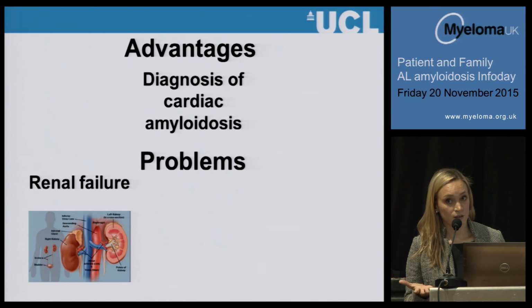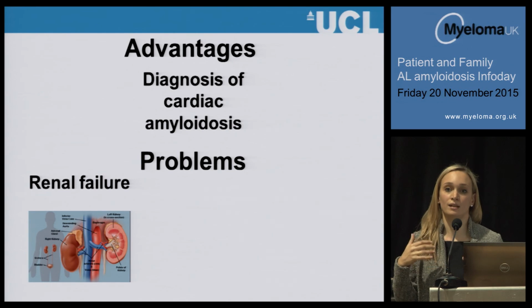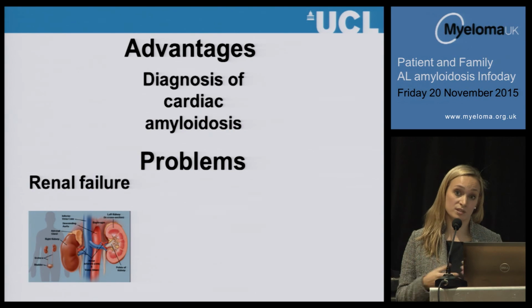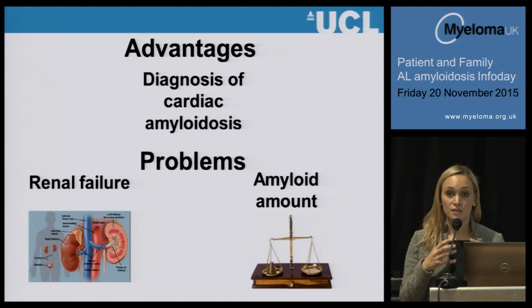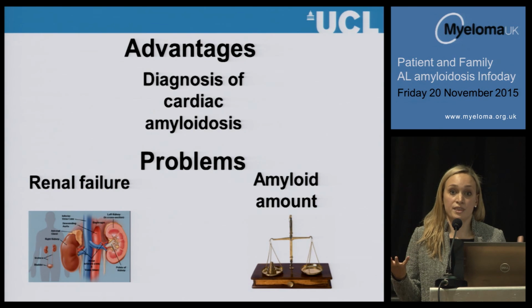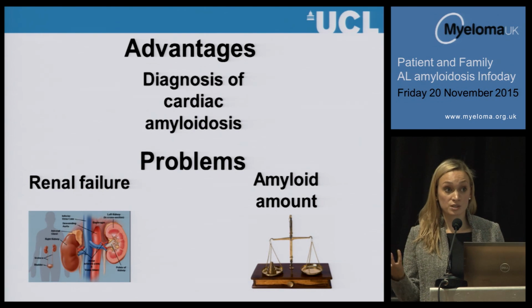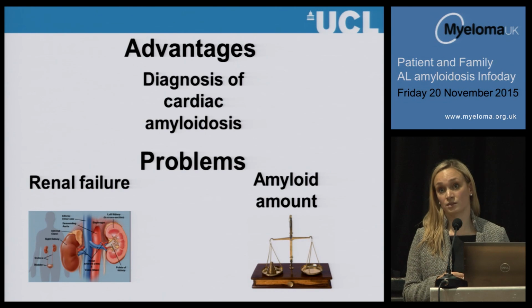Patients with pacemakers, in the majority of cases, cannot have a scan, even though in highly selective cases we can still proceed with a scan. And the pictures I've shown you don't give us information on the amount of amyloid, for example whether 30%, 50%, or 70% of the heart is amyloid. With those kinds of pictures, we cannot answer the question.